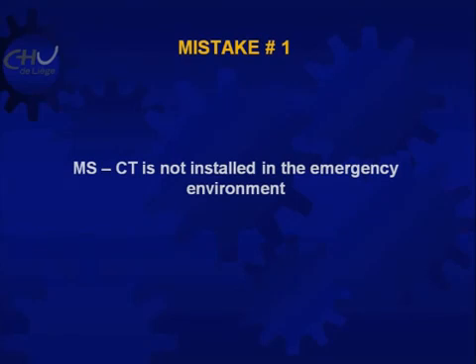The second important message is, if you have to choose equipment for emergency patients, and in particular trauma patients, you should choose the best equipment you have. Not the old equipment should go to the emergency environment, but the best should go there. Why this?